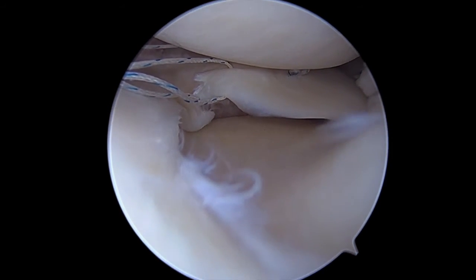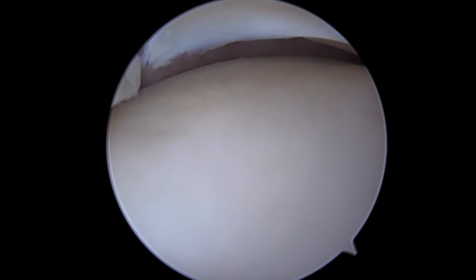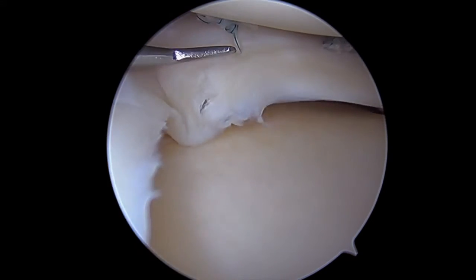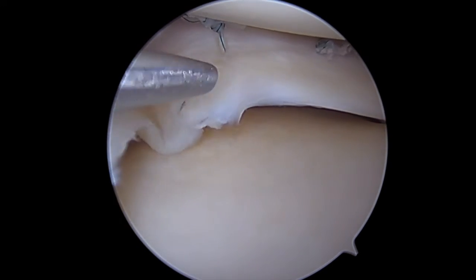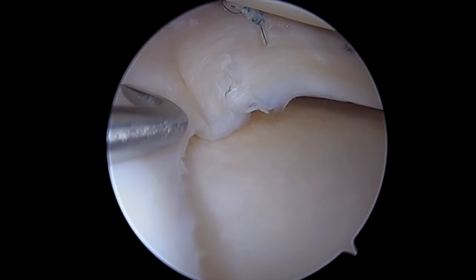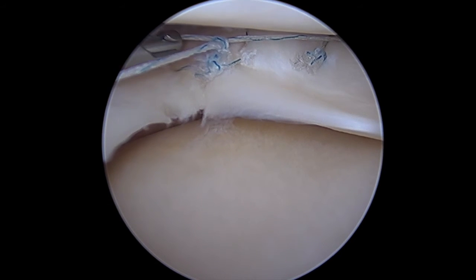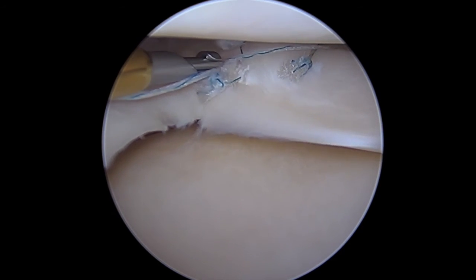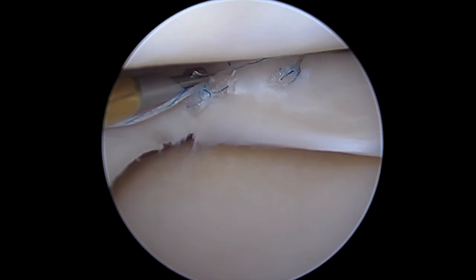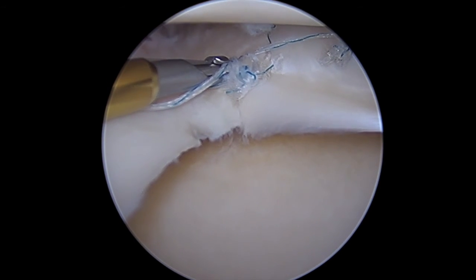Once I've approximated my meniscal capsular margin, I'll go ahead and pass some side-to-side stitches. I pass a little bit longer and oblique because I think there's an internal split within the meniscus right here, so I want to reach past that to compress the meniscal capsular junction tear down as well as compress the internal split within the meniscus. This gives a wider purchase around the tear to compress the femoral and tibial lamina together.